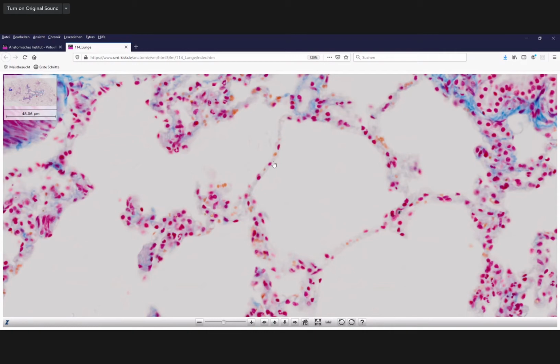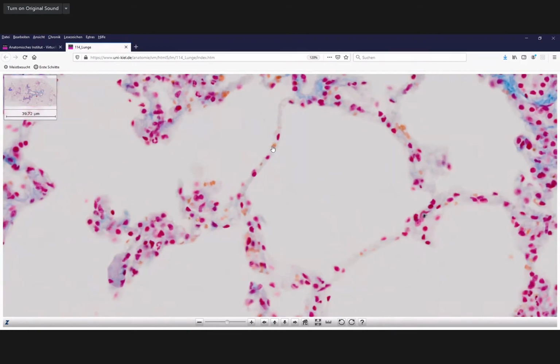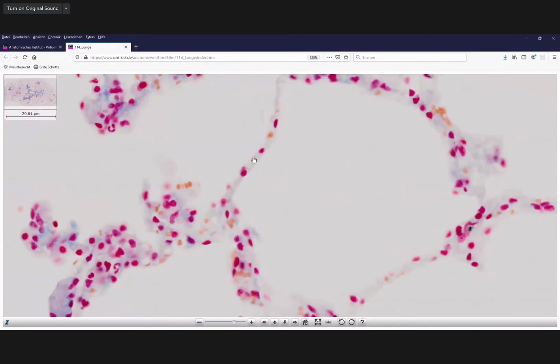And when you look at such an interalveolar septum, you can see that red blood cells are even within this very tiny wall. And you all know that these walls contain little capillaries, which are part now of the barrier between the air and the blood. So there's a very thin wall, which now is the only barrier between blood and air, so that when we inhale, we can take up oxygen easily, and when we exhale, we get rid of the CO2. For that reason, we need a very thin barrier, and that is here in that wall.